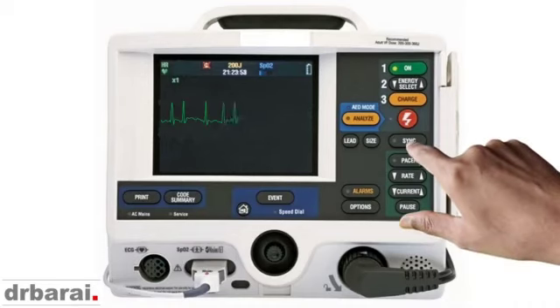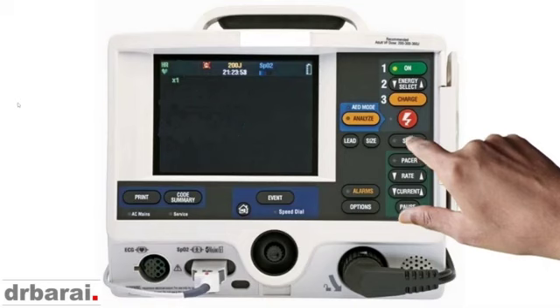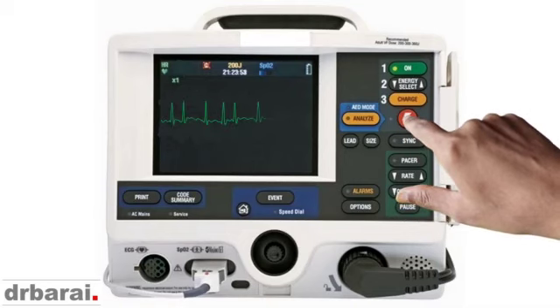In synchronized DC cardioversion, we press the synchronized button here, and then we charge and deliver the shock after procedural sedation. It is different from the defibrillation that we do in case of VT or VF, in that we synchronize this so that the machine will detect when to give the shock. So this is how it needs to be done: at first we press the synchronize button, charge and deliver the shock after sedation.